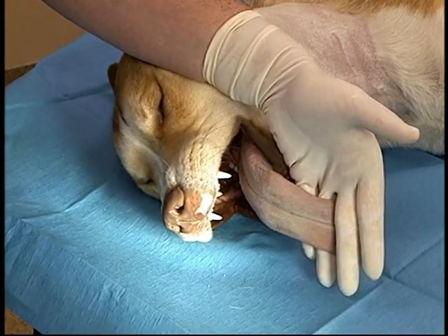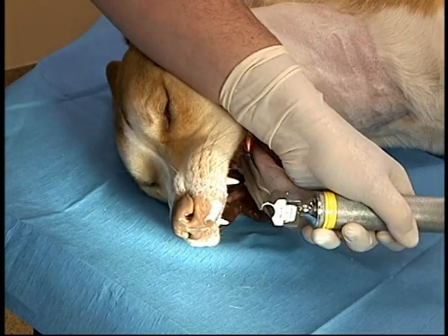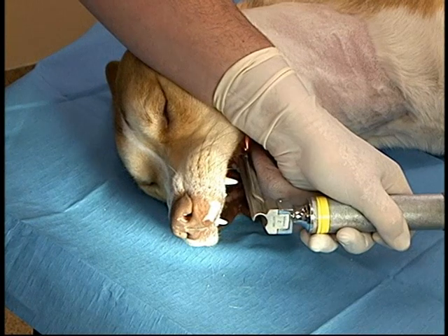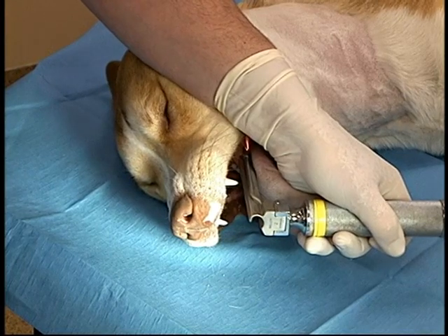The tongue is held between the fingers of the non-dominant hand. The laryngoscope is also held between the fingers of the non-dominant hand and the lower jaw is extended. Then sight along the blade, visualizing the arytenoids, and the patient will be intubated.